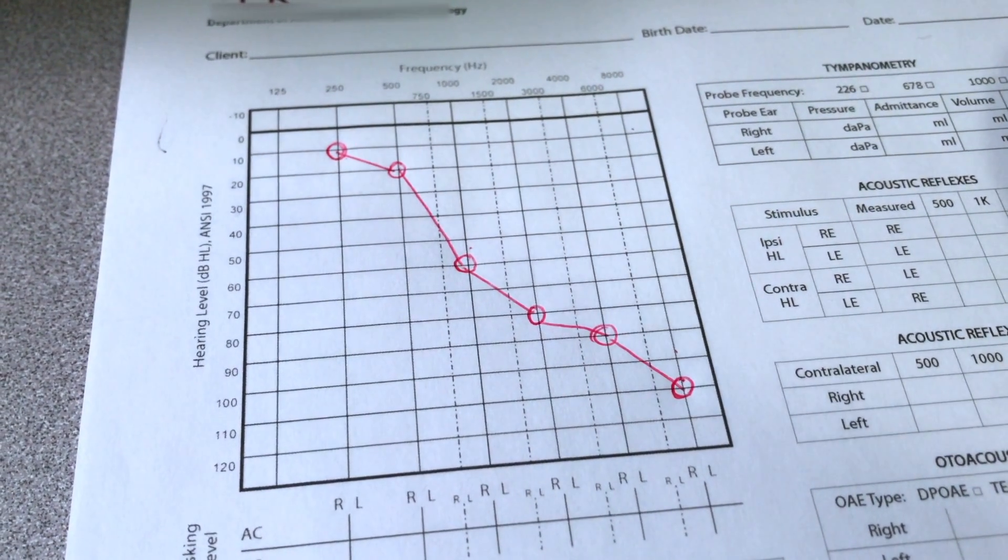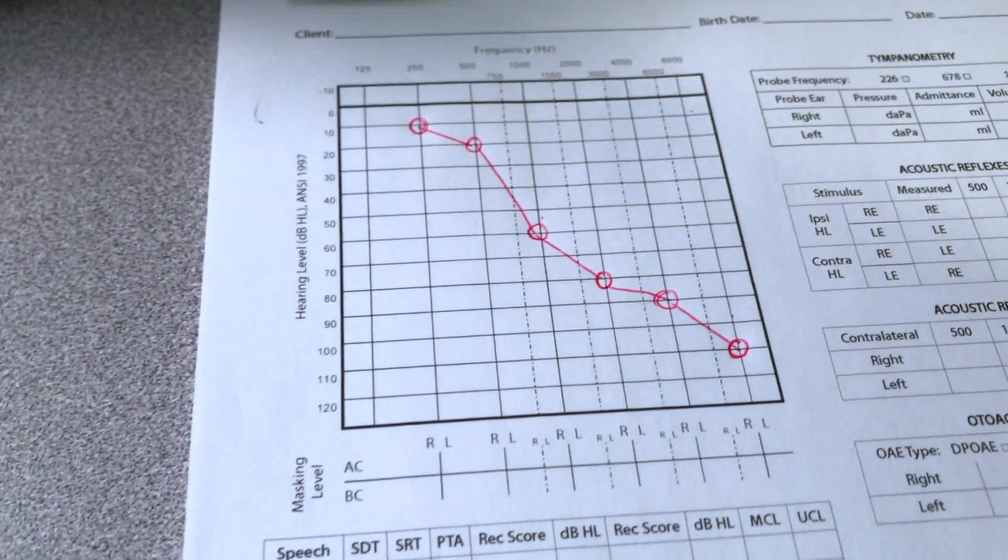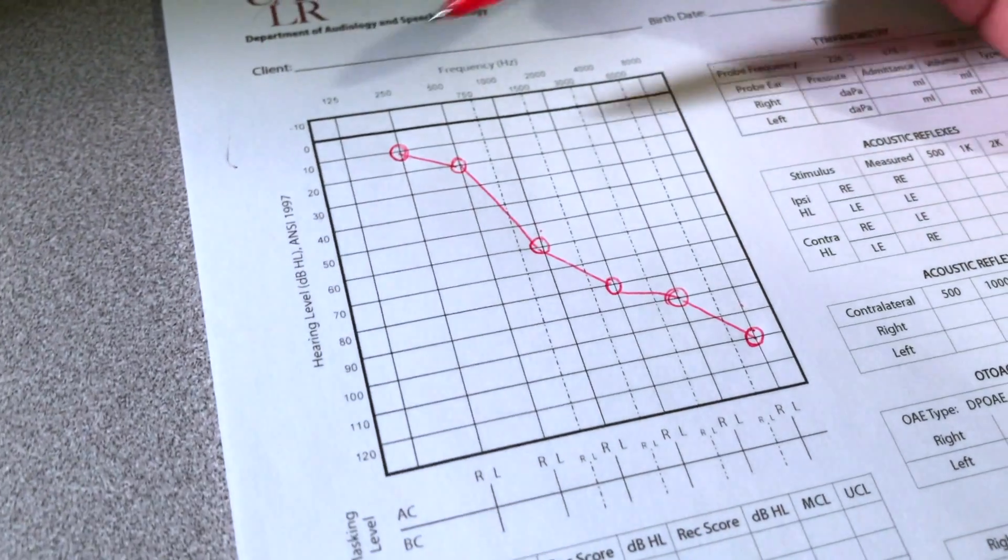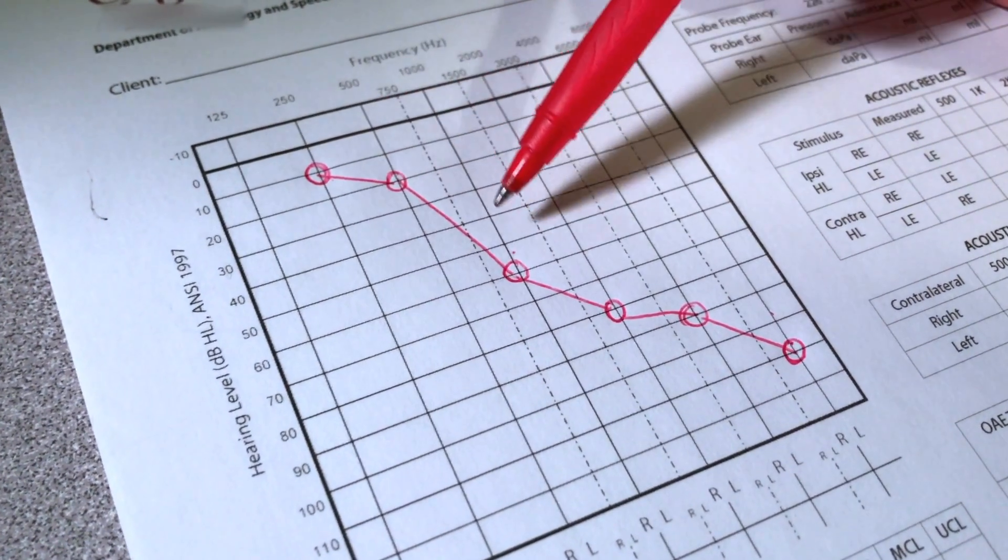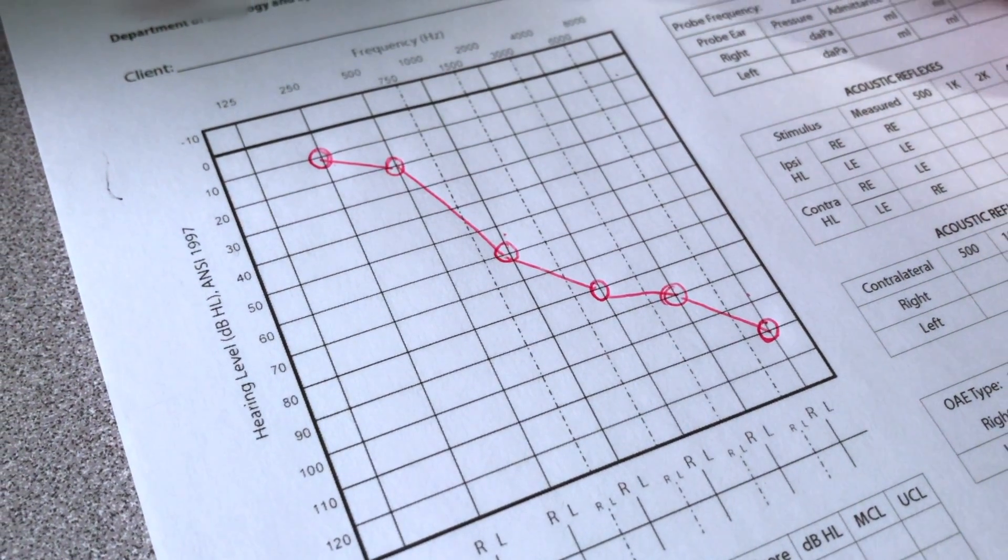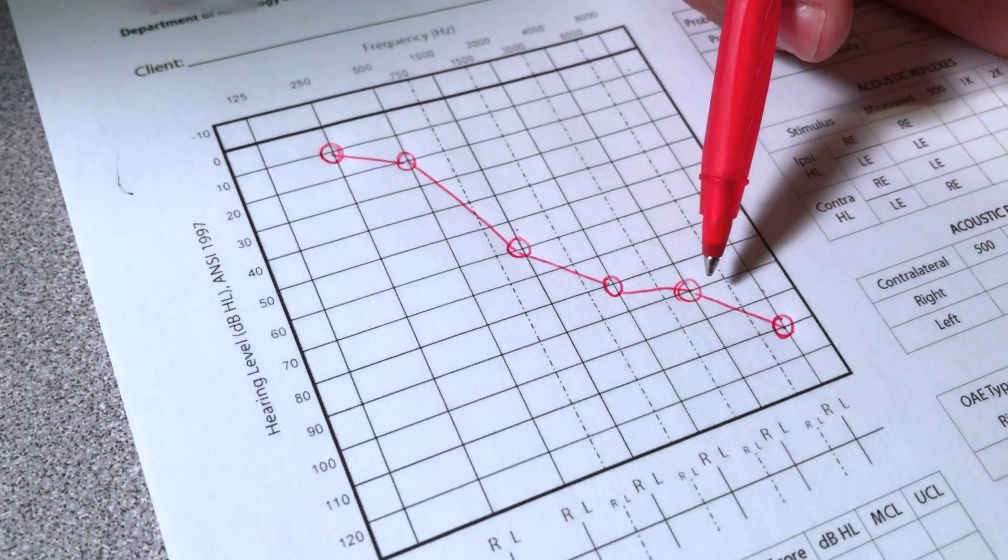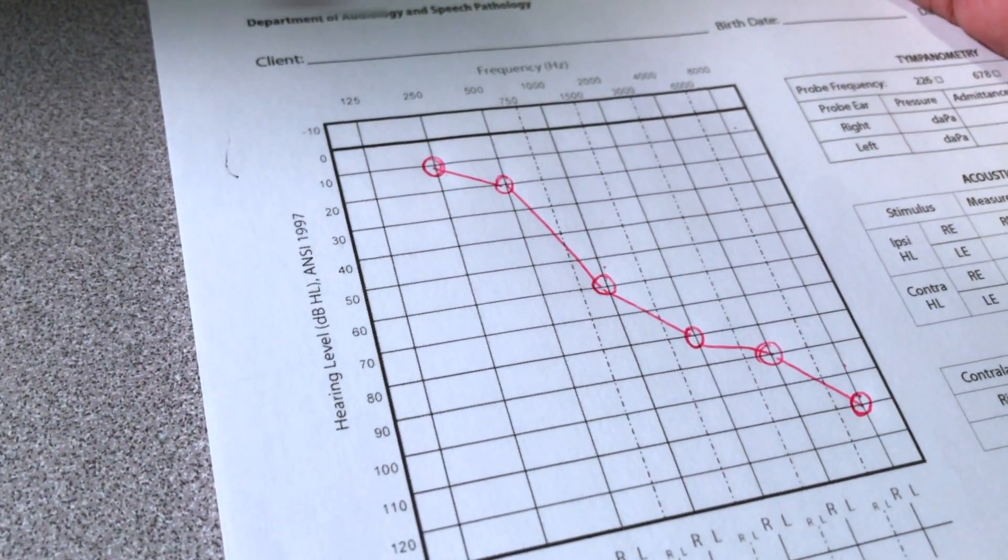This video is about how to perform a TEN test. Before you do the TEN test, first measure the person's audiogram. Here is an example audiogram where the person has a steeply sloping sensorineural hearing loss. We are suspecting the person might have a dead region at 4000, 2000, and 1000 Hertz.